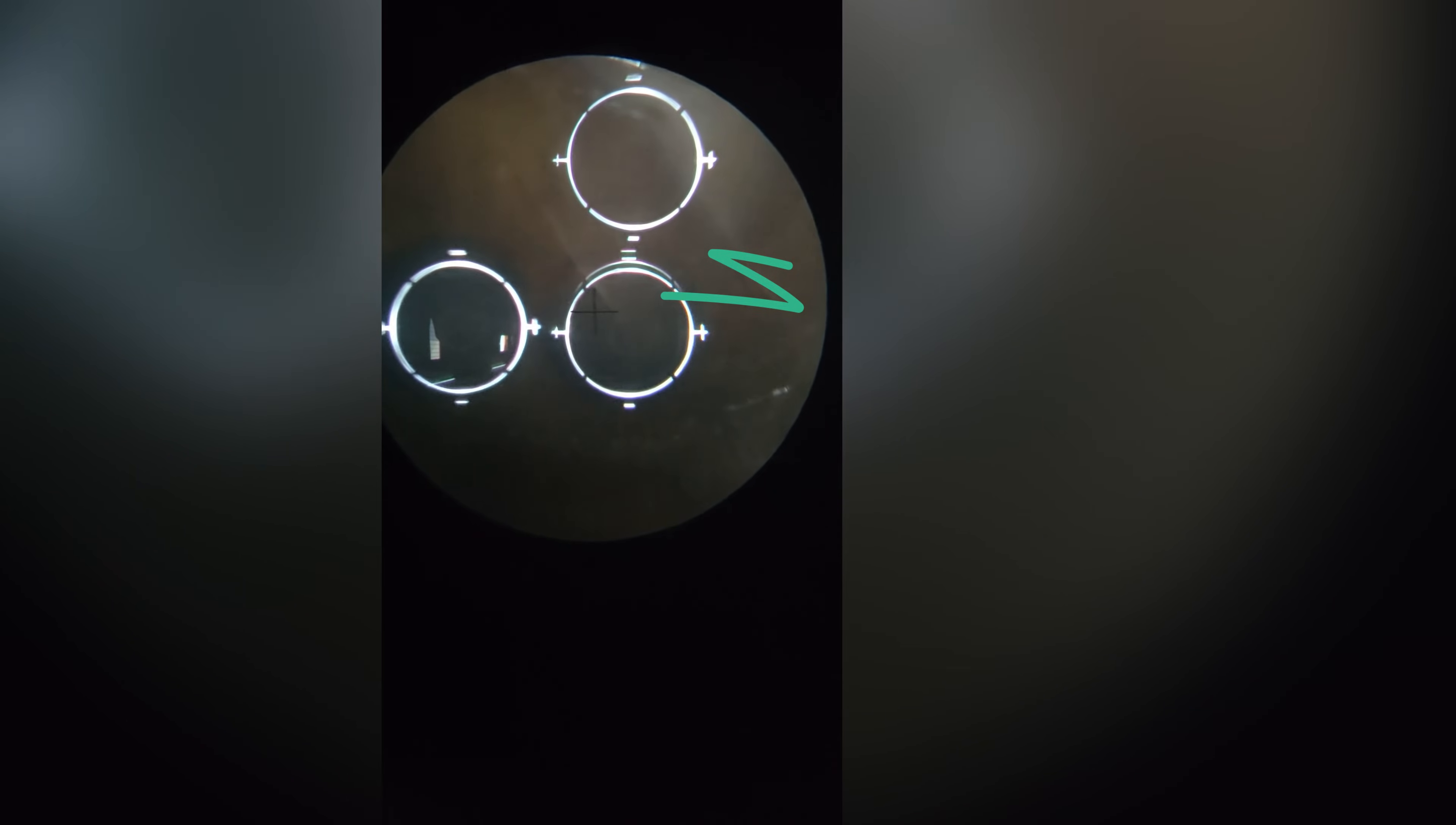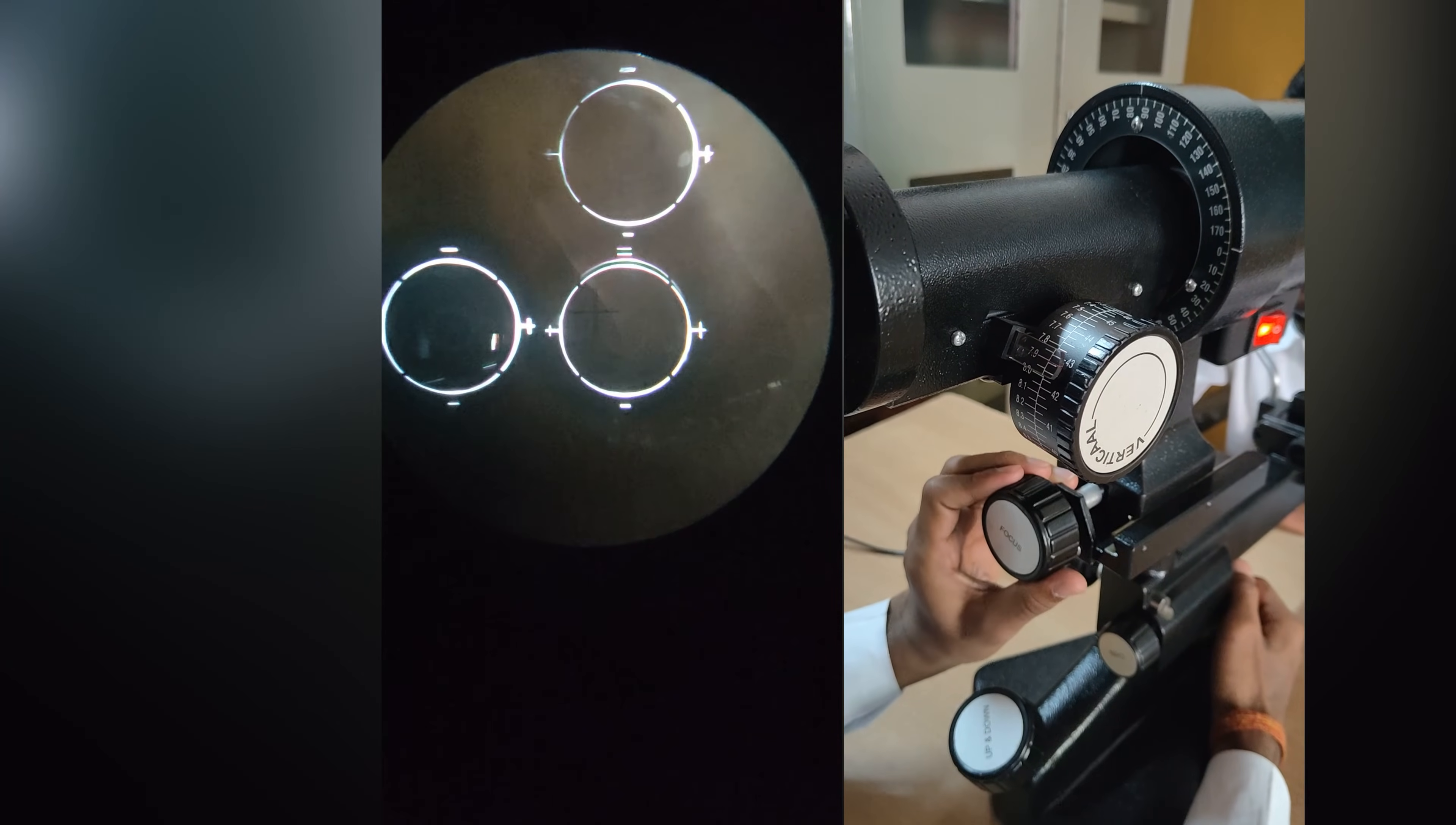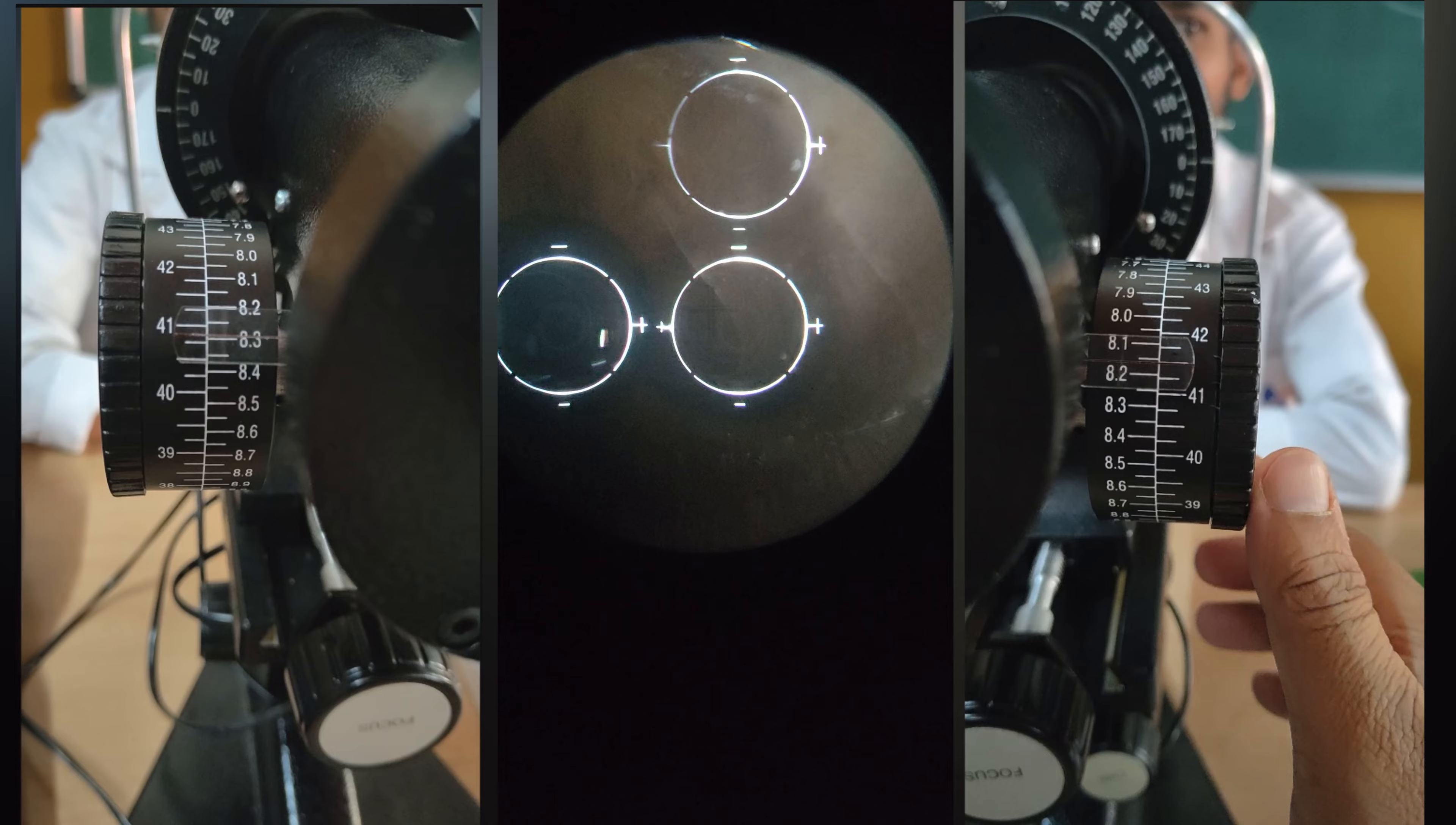Next step is focusing the mire. Looking through the eyepiece, first focus on the mire to get a clear view. Using the focusing knob, make sure the central mire is single. Once mires are focused, adjust the keratometer such that the reticle is in the center of the lower right circle.